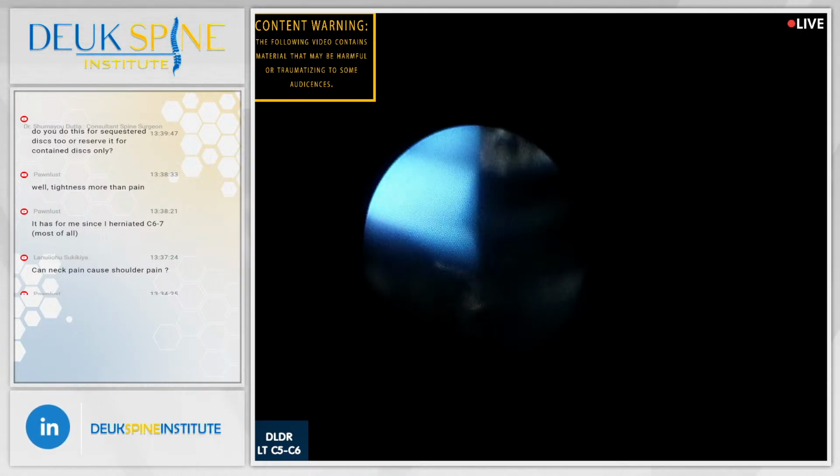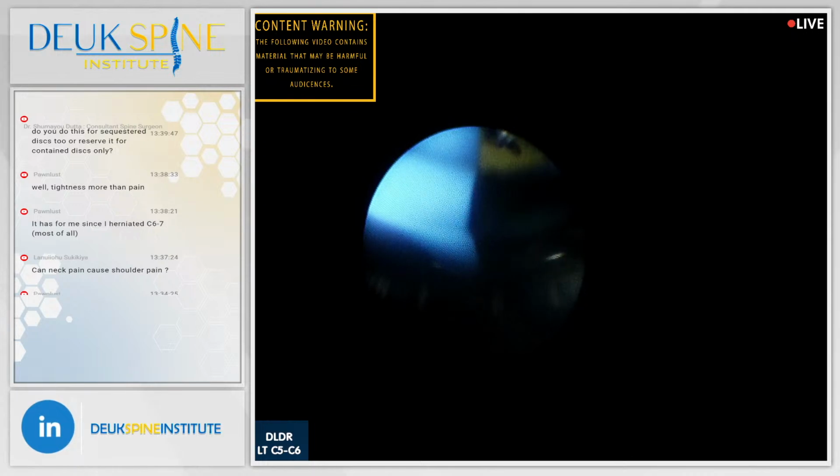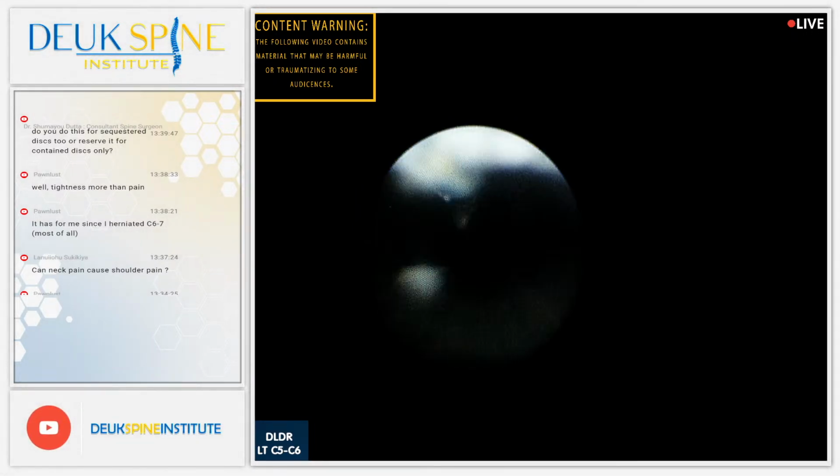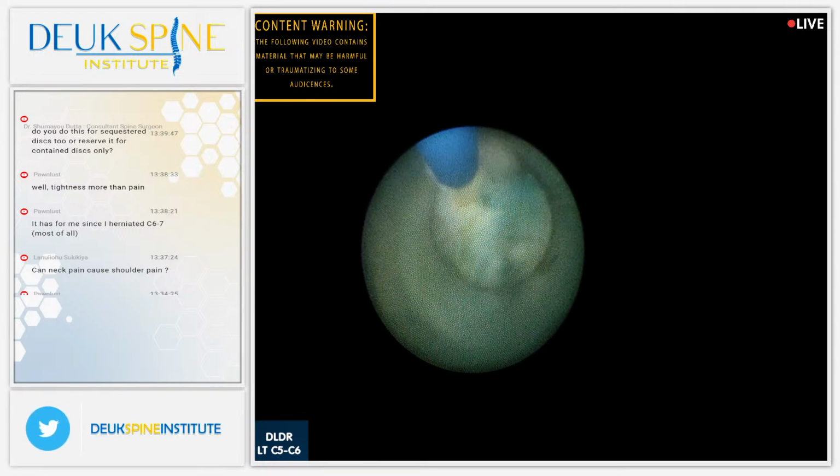Hold the tube, please. You just hold the tube. Okay, I don't want that tube coming out. Alrighty then. Well, we have a few more questions.